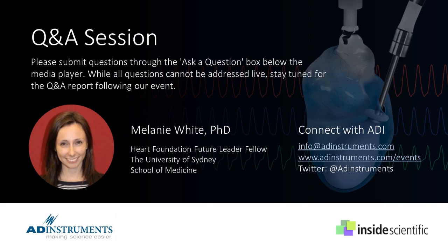Well, once again, it comes back to incision through the diaphragm rather than the period of euthanasia, because different animals will respond differently to the euthanasia. Some of the animals will go down quite quickly. Some of them will take a little bit of time. And that's totally dependent on the animal. And that's why it's key to record that time period from incision within the diaphragm.